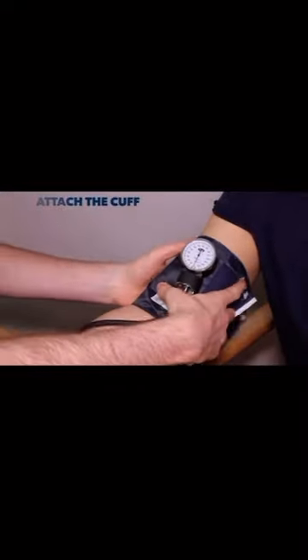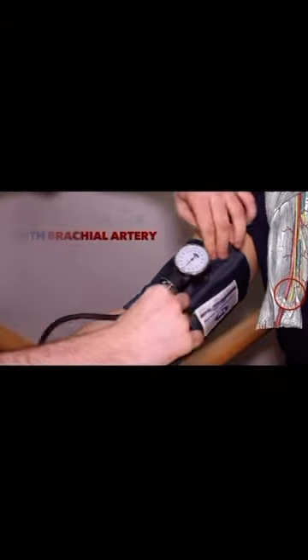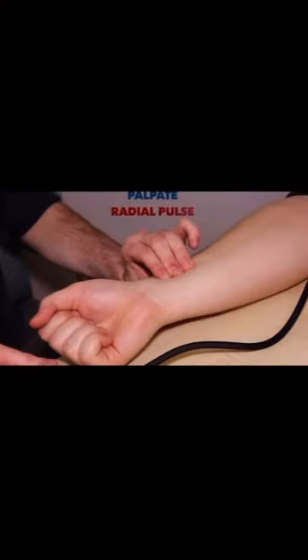Attach the cuff to the patient's arm, aligning the cuff marker with the patient's brachial artery. Ensure the valve on the blood pressure cuff is closed. Palpate the patient's radial pulse, located at the radial side of the wrist. Inflate the blood pressure cuff until you can no longer feel the patient's radial pulse.